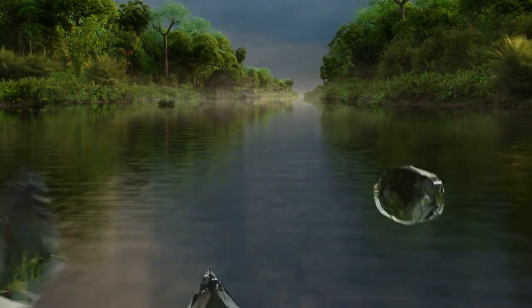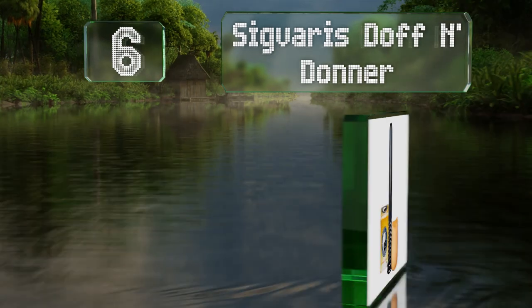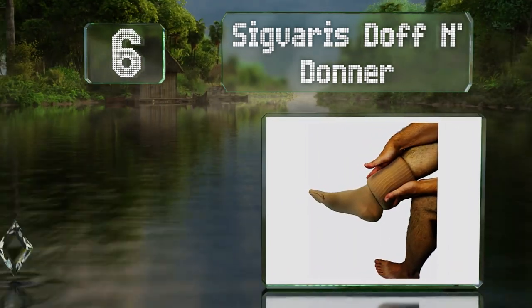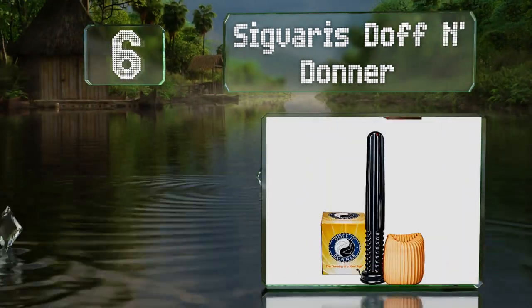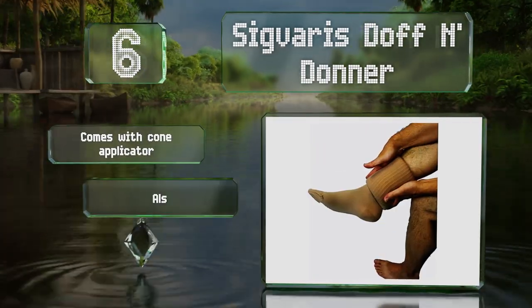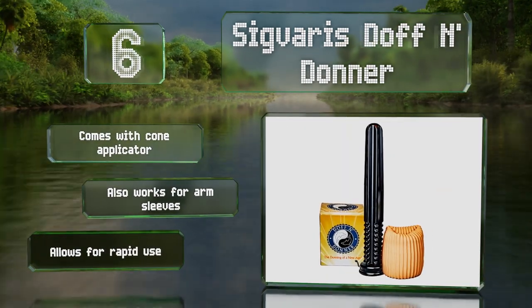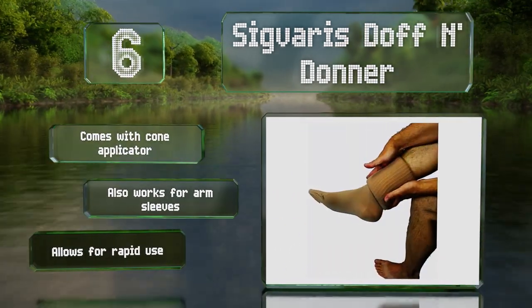Moving up our list to number 6, the Sigvaris Doff N' Donner is not a conventional choice, but once you try it, you might become a convert. Unfortunately, it's not intended for those with severe arthritis in their hands. It comes with a cone applicator and also works for arm sleeves. It allows for rapid use.